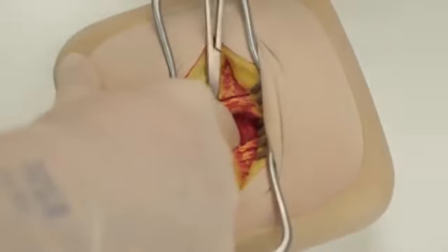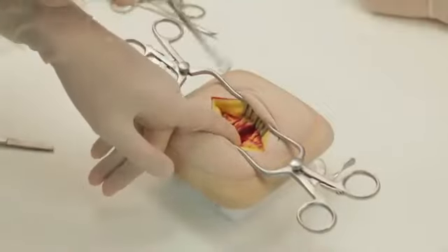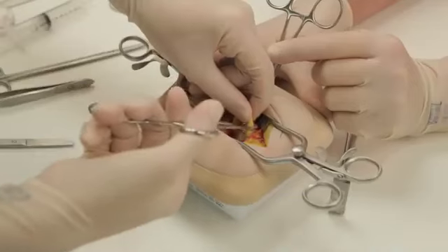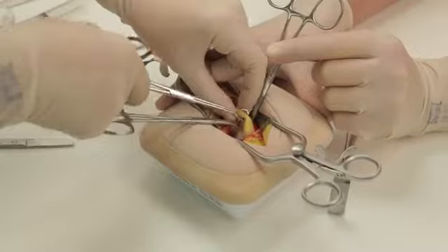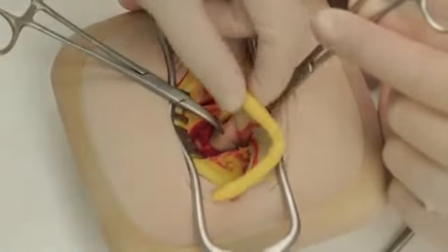It may be possible to deliver the appendix using a finger sweep. In some circumstances, the cecum may need to be mobilised in order to deliver the appendix, but that is not the case in these models. A Babcock forceps can be used to enclose an uninflamed portion of the appendix. In this manner, the appendix can be delivered.